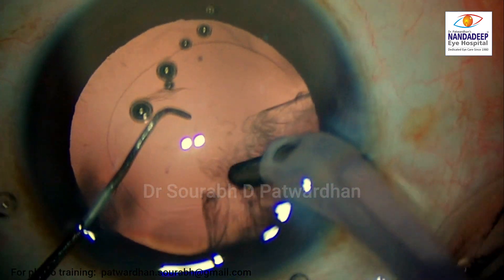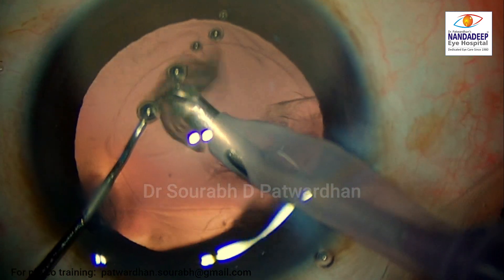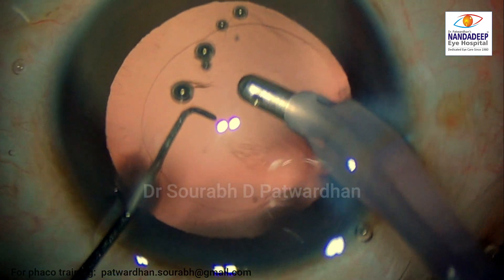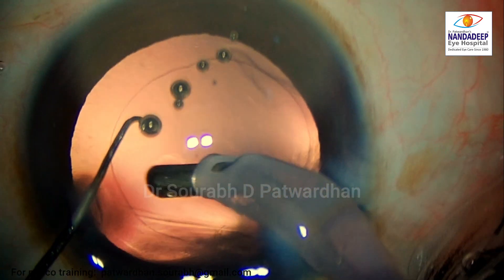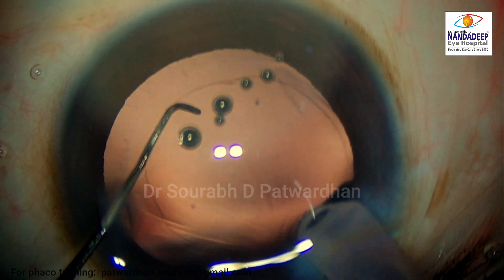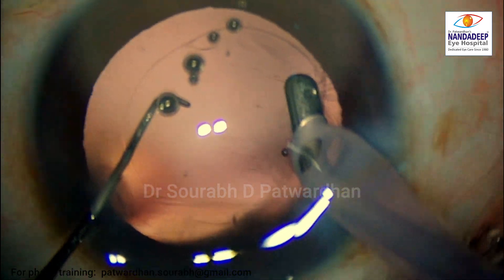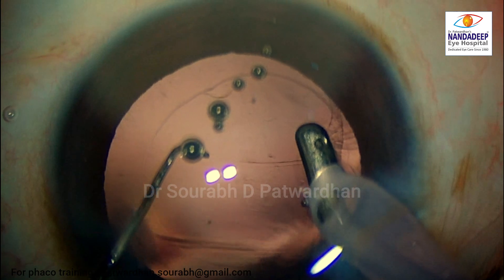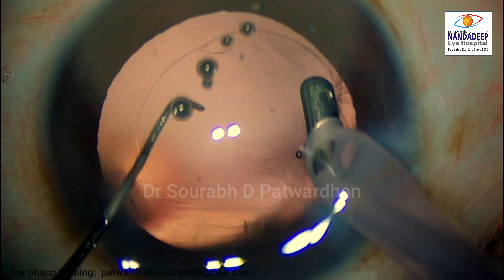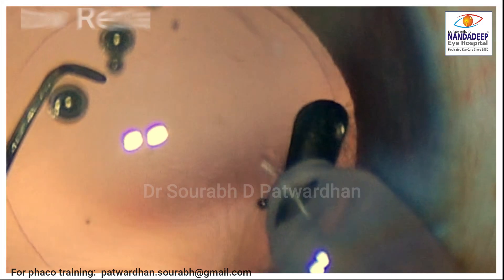This is the regular cortical aspiration going on using the coaxial IA probe. As I go into the sub-incisional area, you will find that there is some redundancy in the posterior capsule. I thought there was some remnant material there, so I tried to polish it off and went into the periphery. You can see the opening of the IA probe is sideways, closer to the redundant posterior capsule, and it has caught hold of the posterior capsule. Once it happens, you have to keep the IA probe very, very steady.